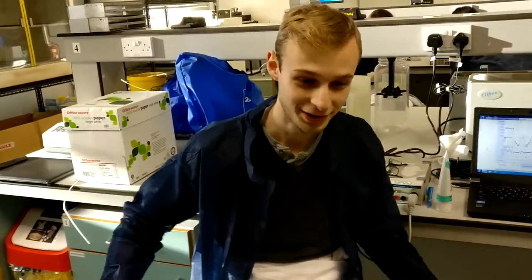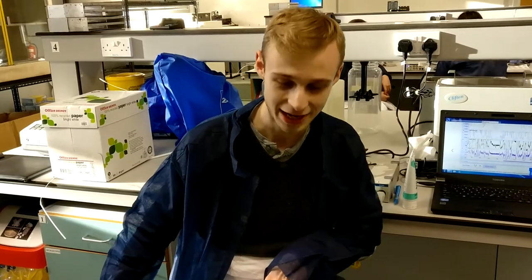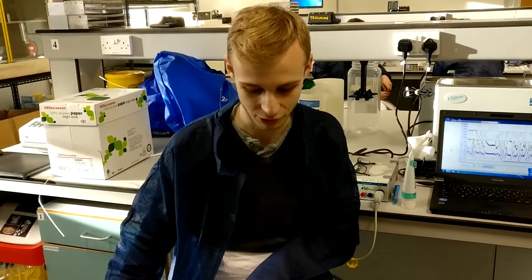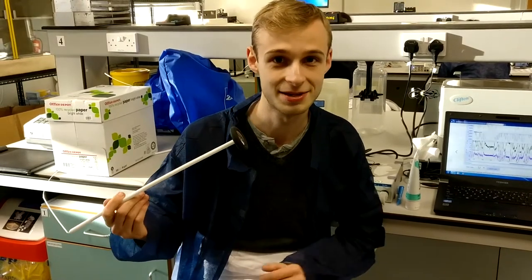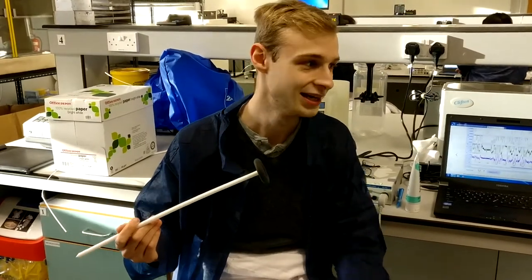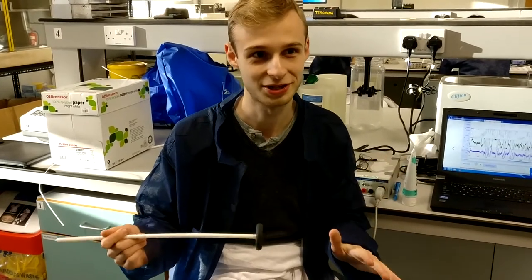Okay, so now you can see this very fetching getup. I had to take my skinny jeans off because I needed to put electrodes on my legs. So we're now testing electrical activity through the quadriceps and hamstring muscles. And somebody's gonna try and elicit my patellar reflex in my knee, and then we should see that come up on the screen as a jump in electrical activity.